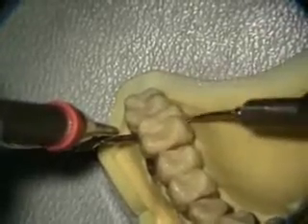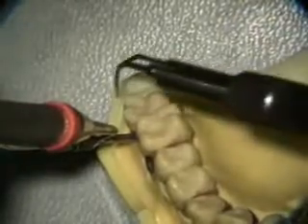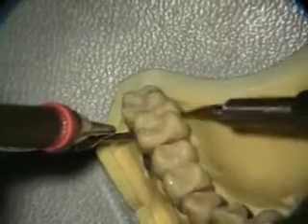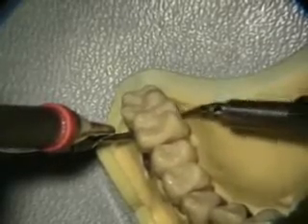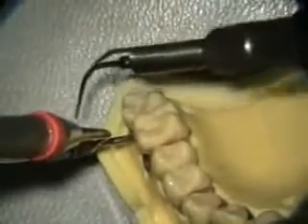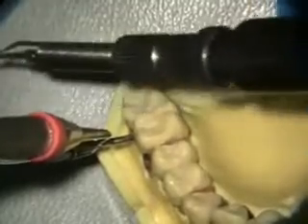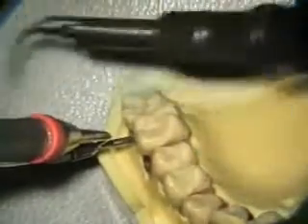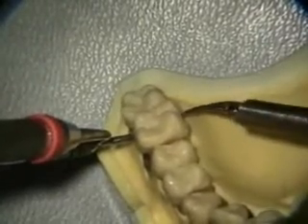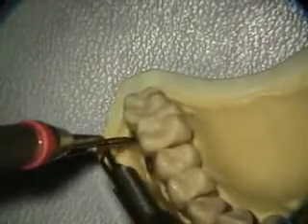Sometimes you have to cross instrument, and because I don't want to turn the instrument or rotate the insert, I just tolerate the torque and spin it, but I'm holding on to the handle. I don't hold on to the insert very often at all. It's better to spin something at a bigger diameter than at a smaller diameter. Okay, so sometimes I cross instrument, not much on the upper, definitely more on the lower.